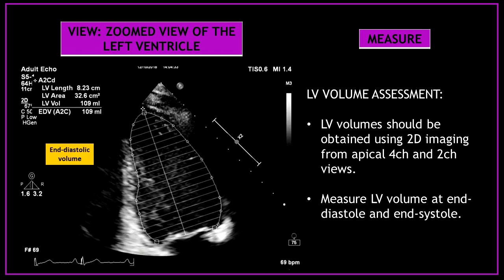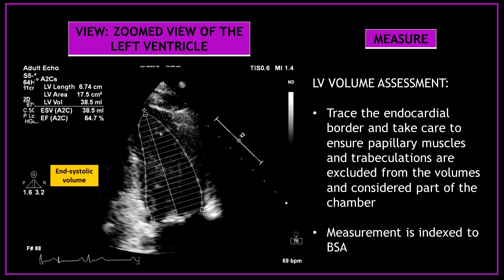In this same view, assess the left ventricular volume. Left ventricular volumes should be obtained using 2D imaging from apical 4 chamber and 2 chamber views. Measure the left ventricular volume at end of diastole and end of systole. Trace the endocardial border and take care to ensure papillary muscles and trabeculations are excluded from the volumes and considered part of the chamber. All measurements need to be indexed to body surface area.